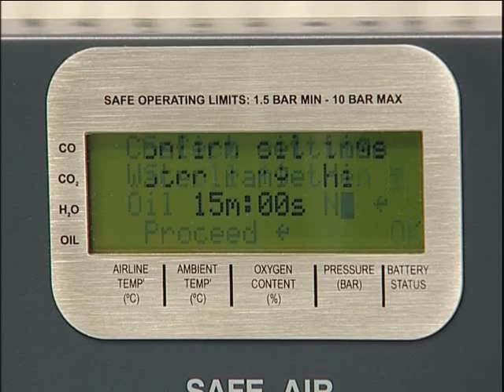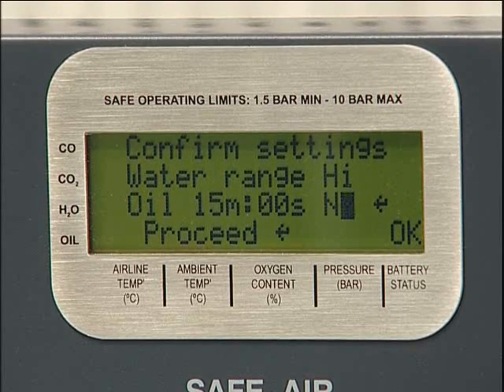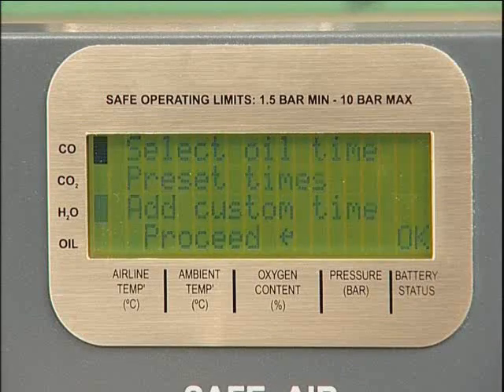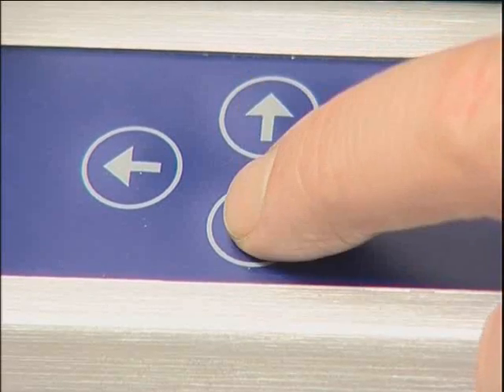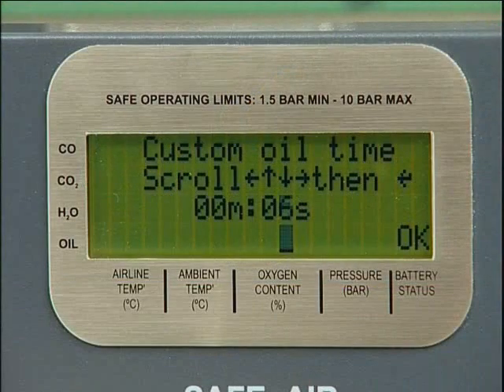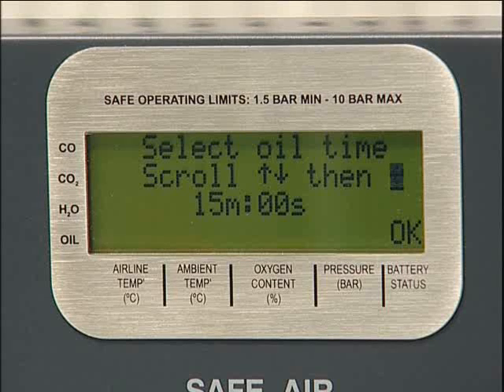Press enter to confirm your selection. If the oil being used does not correspond to a preset time, the unit has the capability to be programmed with a custom time. This will be stored with the presets for future tests and will remain in the memory until a new custom time is entered. If an oil time is not selected, the unit will default to 15 minutes. This setting should be used if the type of compressor oil potentially in the system is not known or there is a risk of cross contamination from other oils.